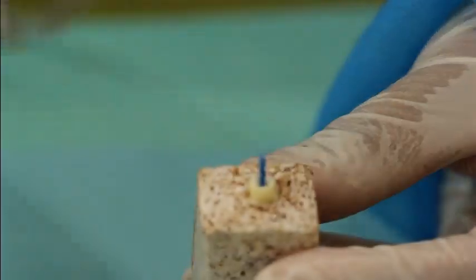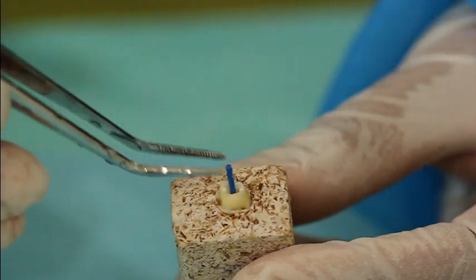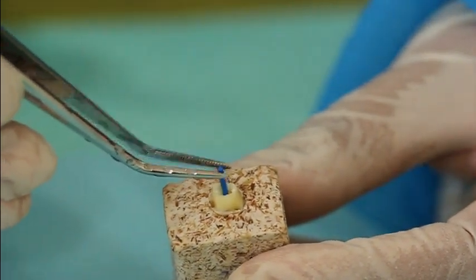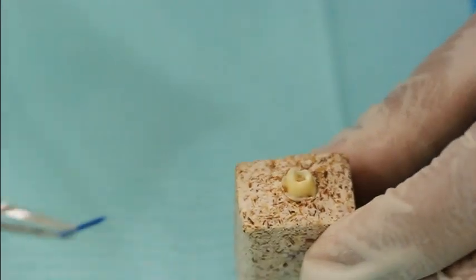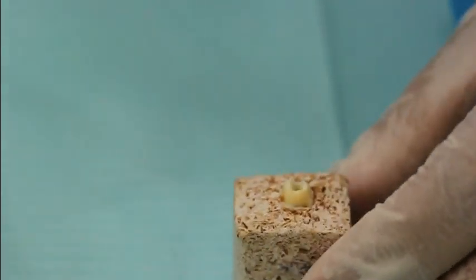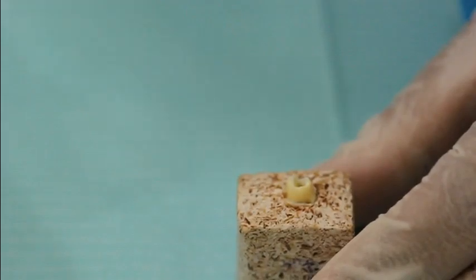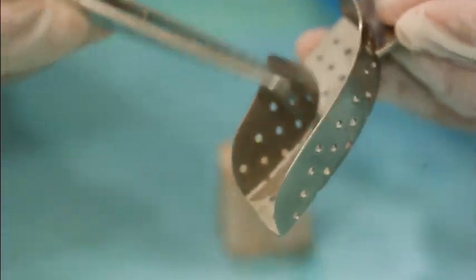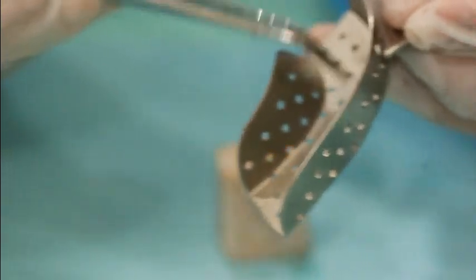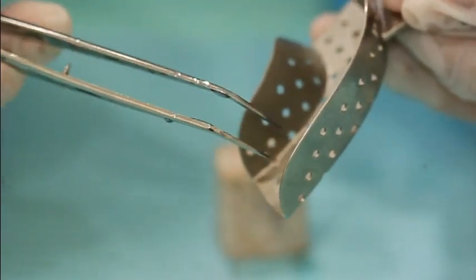If possible, you should have an assistant to do this procedure. Okay, don't forget to apply BPS adhesive on the tray before you load the impression material.